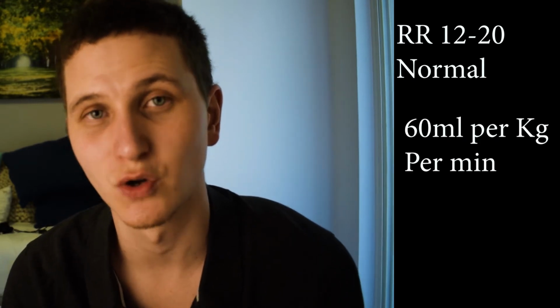And then you want to set your maximum pressure, which is about 20, 25, 30, somewhere around there. Probably stick around 20. And then obviously your rate, your respirations, how fast you want the patient to breathe. You want to aim for what is normal. Normally we are breathing 60 cc's per kilogram per minute. That is your minute volume.